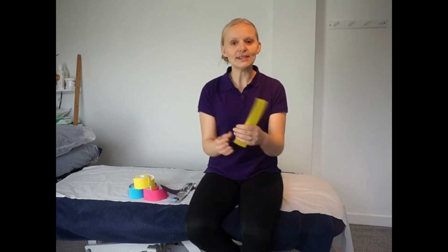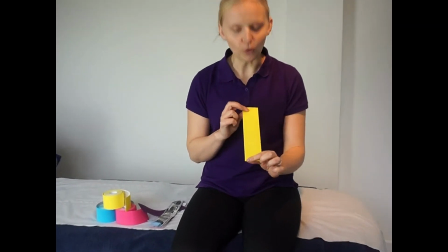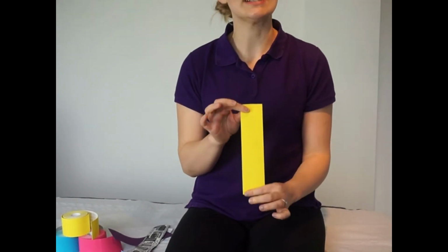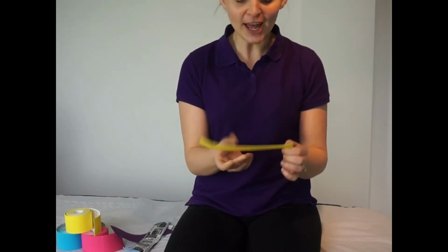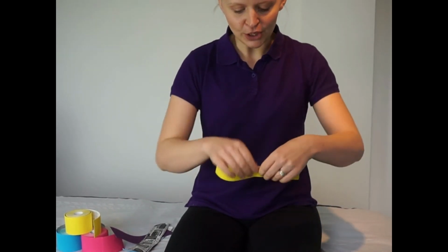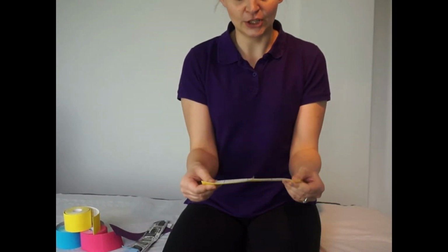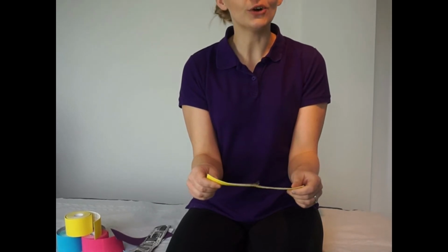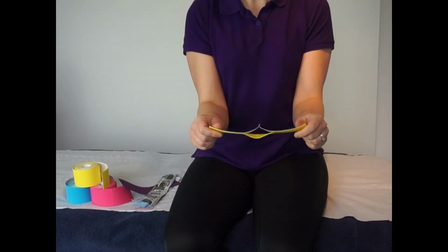So yellow tape, it's the 5cm tape. And again, as Pentony mentioned before, all the colours don't make any difference in terms of the tape themselves, but it's quite a nice colour to have for your clients. So first thing I want to do is just pull away the tissue, the tape from the tissue, so we can test the recoil to begin with. So if I pull that tape from there and see if it comes back.